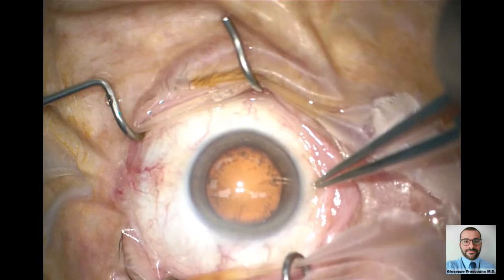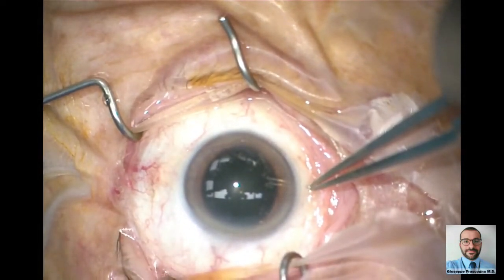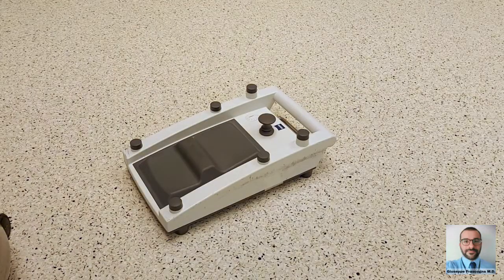Oblique light is instead misaligned with the optics — it is widespread and illuminates the whole field surface. Regardless of the microscope model, these two light types serve complementary roles during surgery.